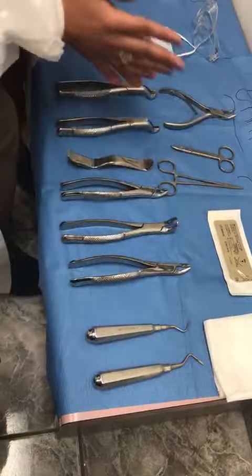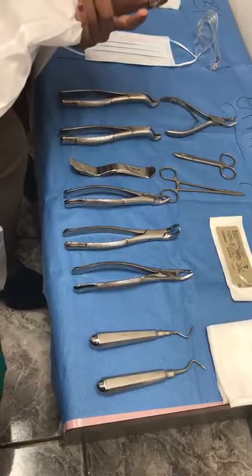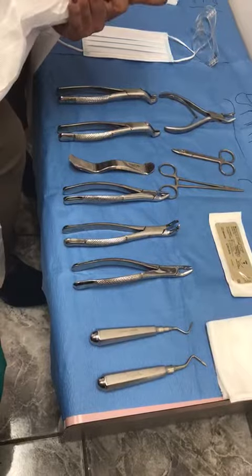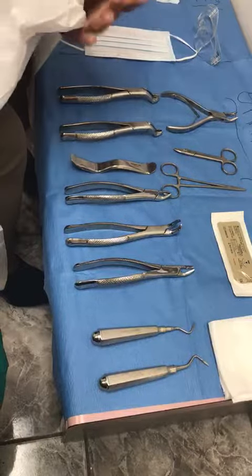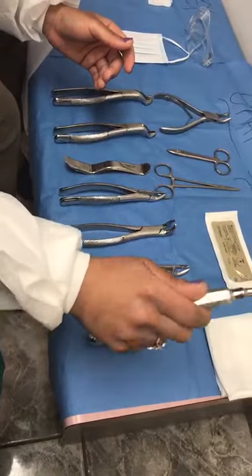If the tooth is broken off and the crown of the tooth is gone, when doing the extraction they go around with the high-speed handpiece and the surgical burr to loosen it up. Then the doctor takes this, elevates it, and pushes the tooth up — and that's how the root of the tooth comes out.